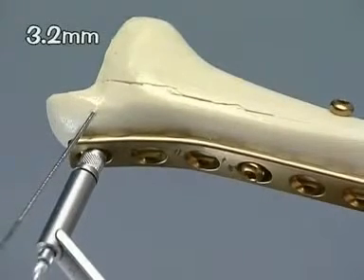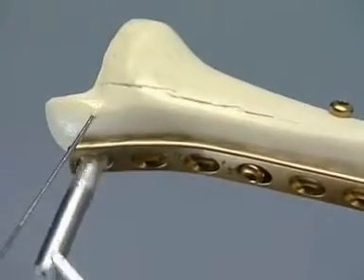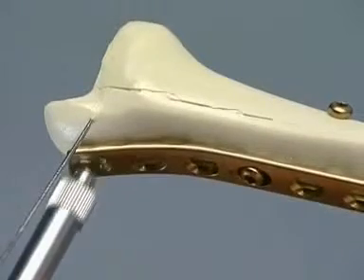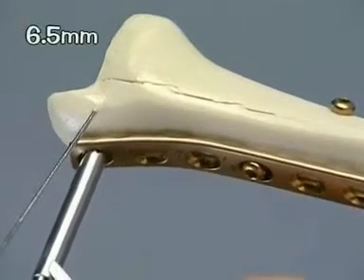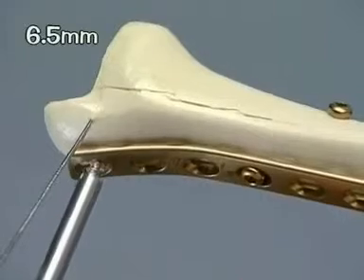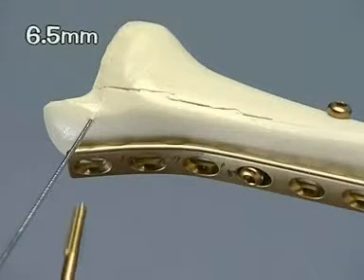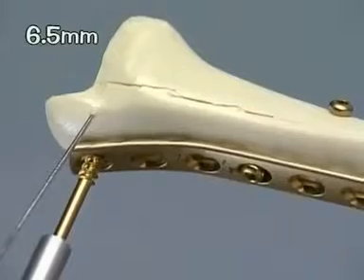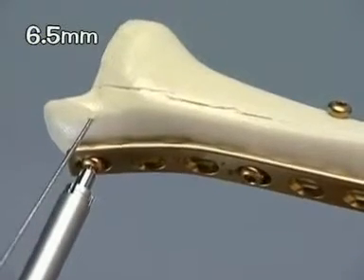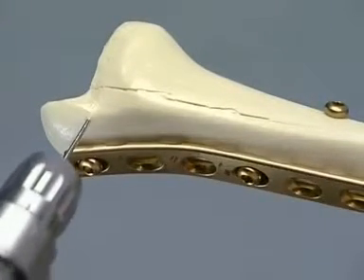Drill the hole parallel to the joint without penetrating the distal cortex using the 3.2 millimeter drill bit. Measure the depth. Tap using the 6.5 millimeter tap. And insert the 6.5 millimeter cancellous screw with short thread. Interfragmentary compression is achieved by tightening the screw. The K-wire can now be removed.